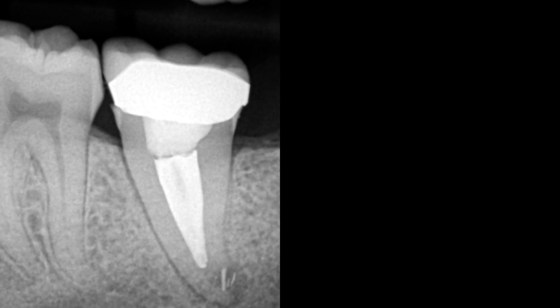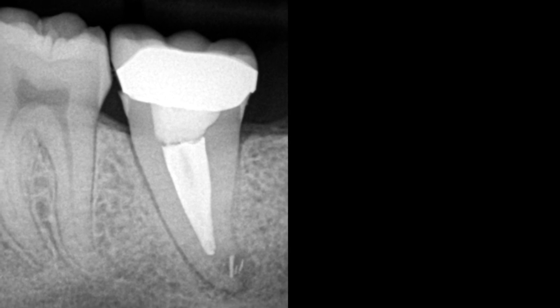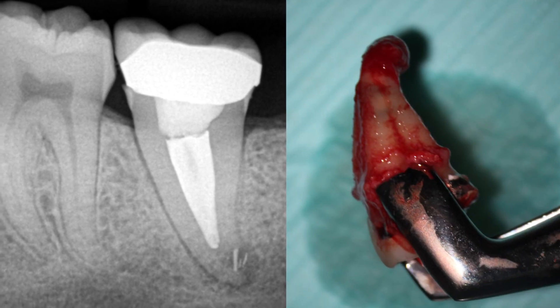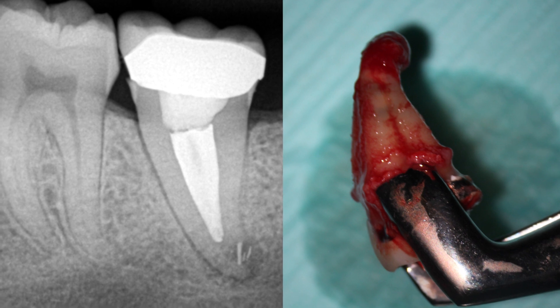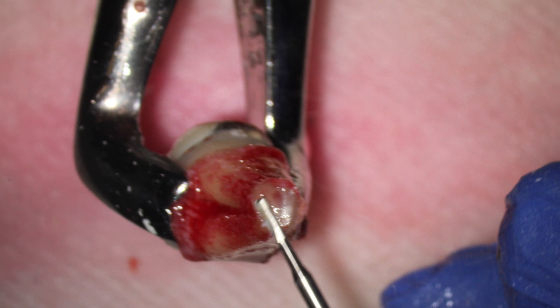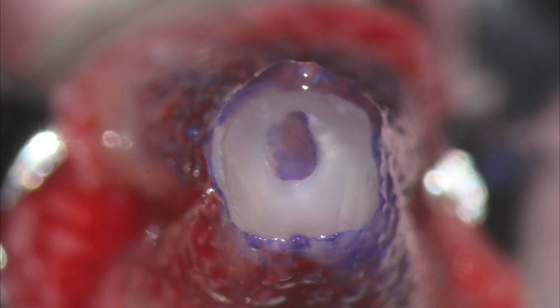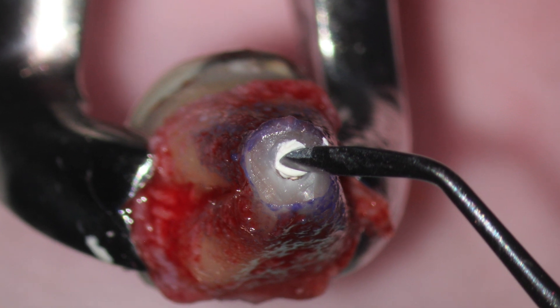A patient presented with a failed root canal treatment of a lower second molar. These teeth are ideal for intentional re-implantation due to the conical root shape, which makes extraction really easy. The tooth was resected and dyed with methylene blue to detect any fracture, then retroprepped and filled with bioceramic.